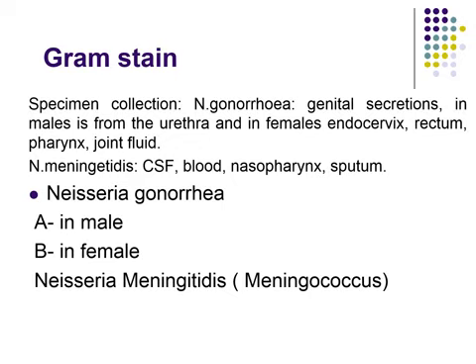Why? It is not a definite diagnosis in a female gram stain because many normal flora found in the vaginal mucosa resemble Neisseria species in morphology, such as Gardnerella species and other bacteria.